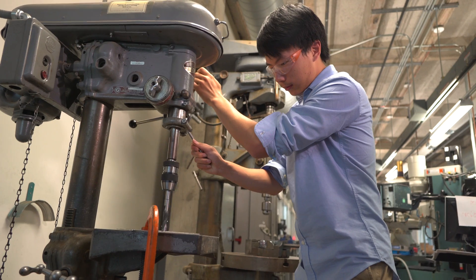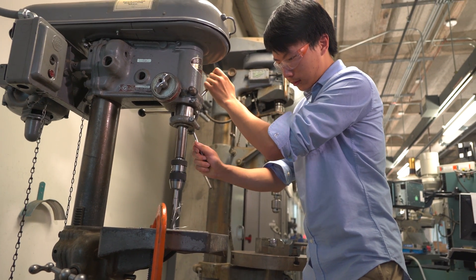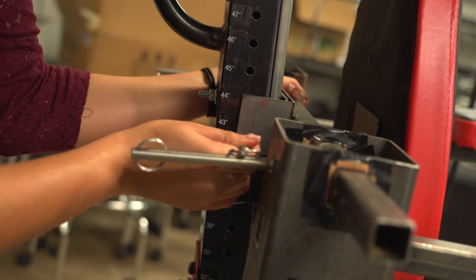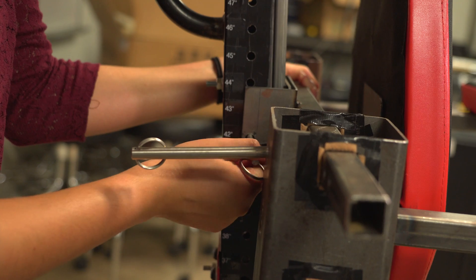As a freshman you face a lot of introductory classes and some freshmen don't get to see engineering design firsthand, but we got to build something and create a real-life solution to a real problem, and that was a unique experience.